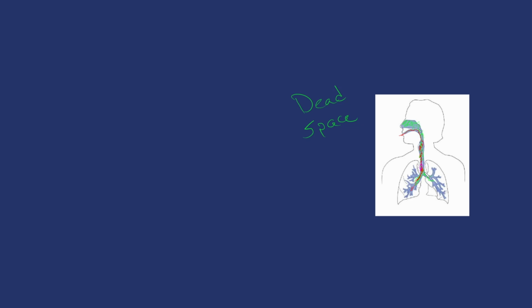So there is a lag time whenever we're doing our capnography because of this. Okay. So now knowing that, with our respirations and how CO2 is going to kind of change here, we'll draw this out. So we breathe in. As we breathe in, and if we're measuring right here at, say, the mouth, right? As we breathe in, the level of CO2 isn't going to change from the air. It's going to be just a flat line. There's no change here. We breathe that in, there's no change. We start to breathe out, and we still don't see a change yet because we have that dead space. So there's nothing really going on just yet.